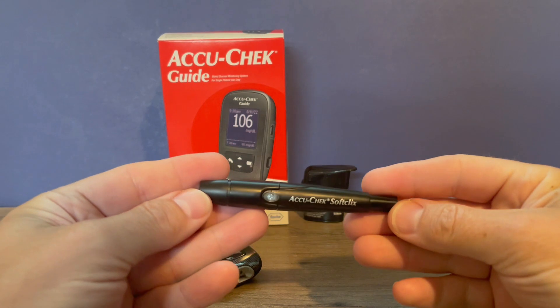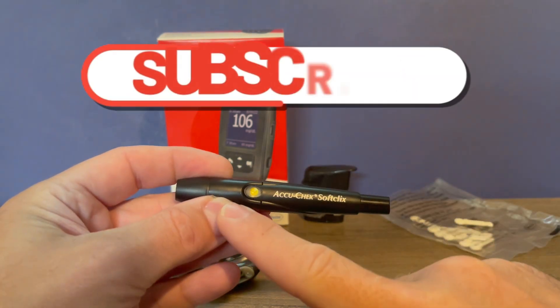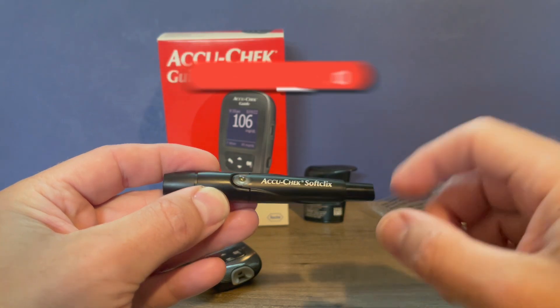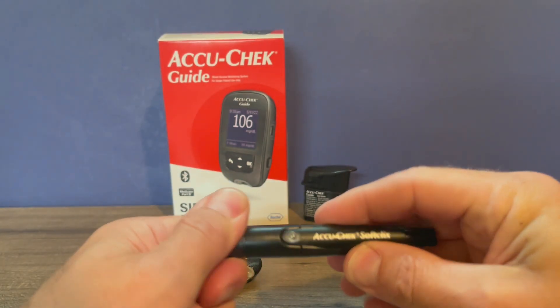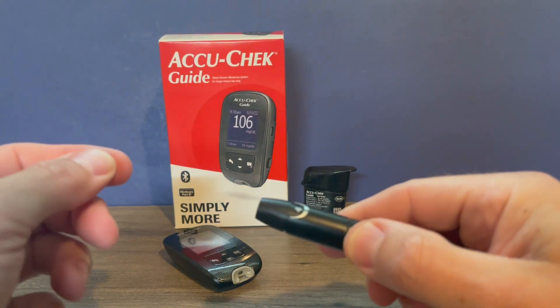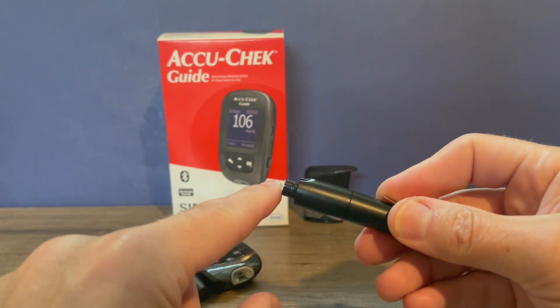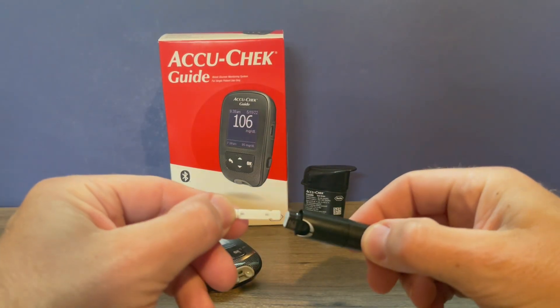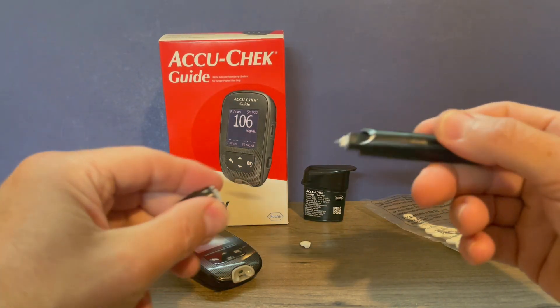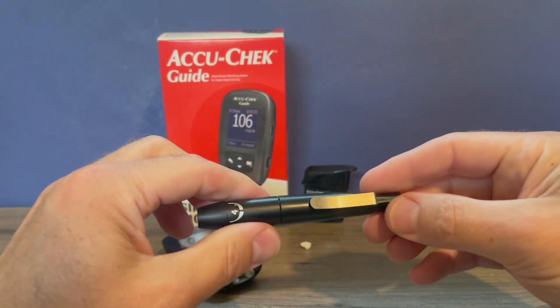Next we want to familiarize ourselves with the lancet device, which is what you use to poke your finger to produce the drop of blood. Pushing on the end of the lancet device will charge the spring — the window is yellow when the spring is charged and clear when it's not ready. The cap to insert lancets just pulls off, and you want to be certain the notch on the cap is lined up with the notch on the lancet device when you replace it. The sleeve serves as a lancet eject — push it forward and it ejects the lancet. Insert a new lancet until it's fully seated, twist the top off, save the top for disposal, line up the notch, replace the lid, then adjust the depth. I generally start around three or four and adjust from there as needed.